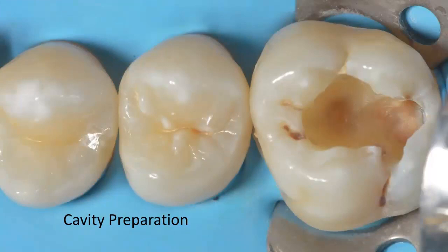After preparing the cavity, the difference between the preparation for amalgam and for composite is that in amalgam we need specific depths, specific axial depths, line angles, and a straight floor, but with composites we usually don't need any such preparation because bonding is accomplished as a separate step. So we just need to remove the carious lesion with a round bur or a carbide bur, starting with the high speed and ending with the slow speed handpiece. That will control the cavity preparation.